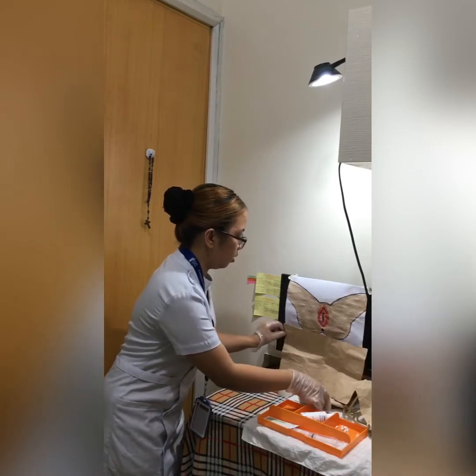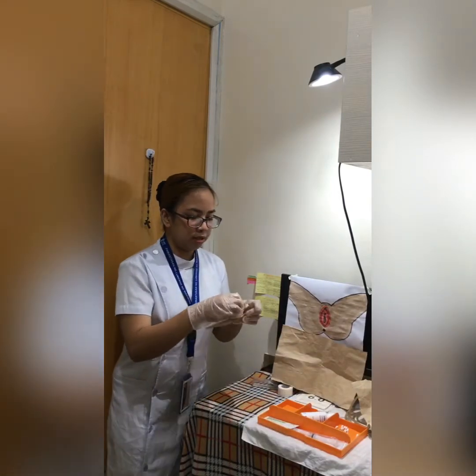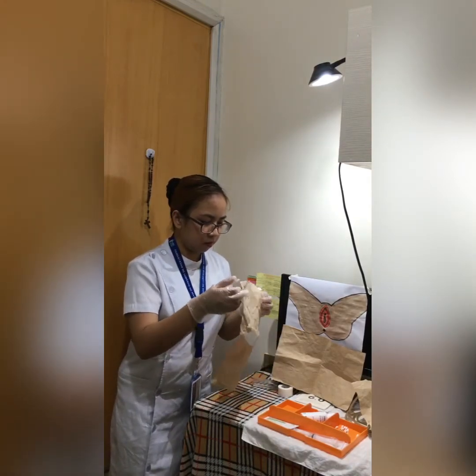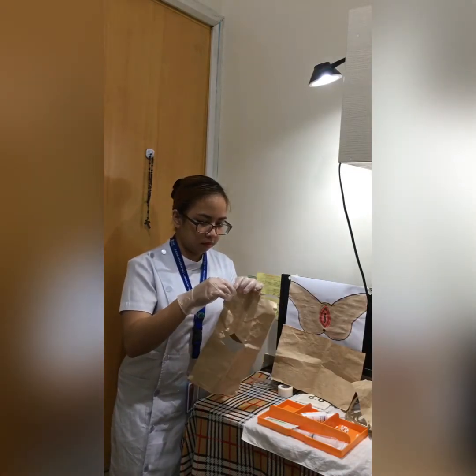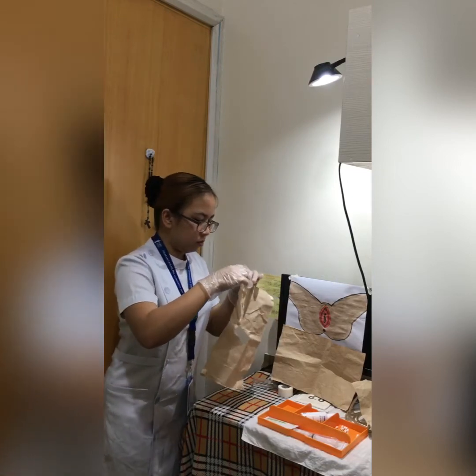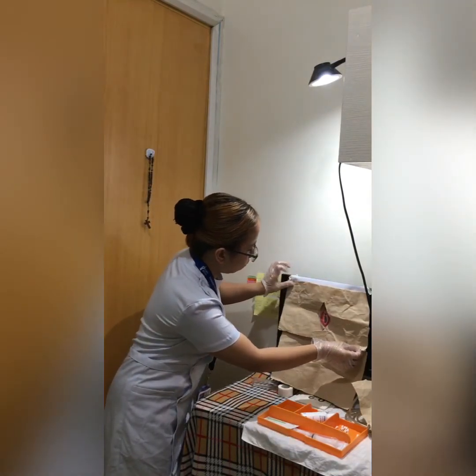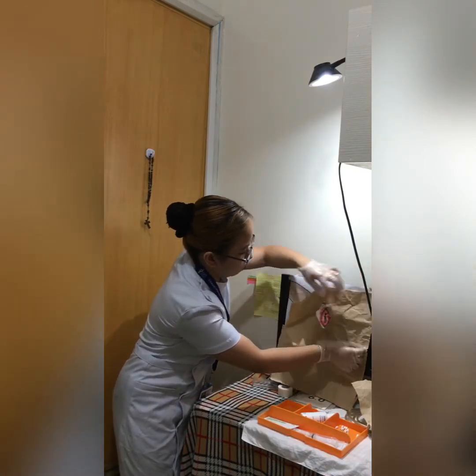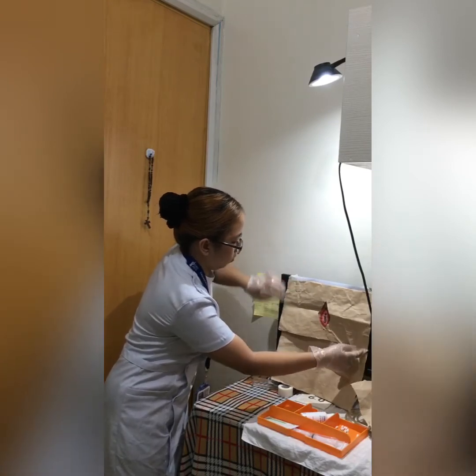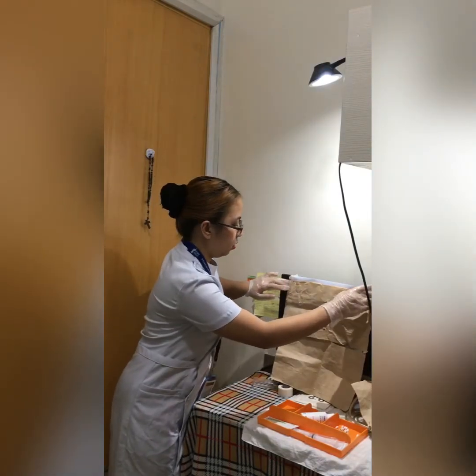Next, I'm going to place another drape, exposing only the area that is involved in the procedure.